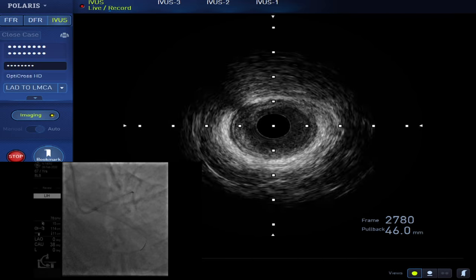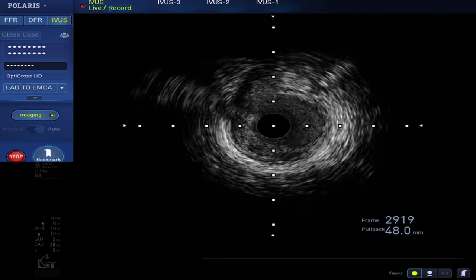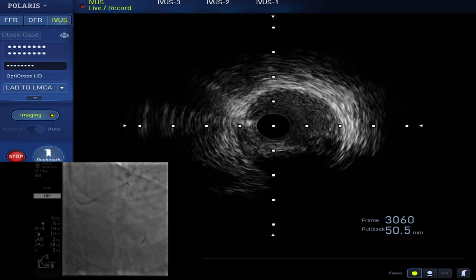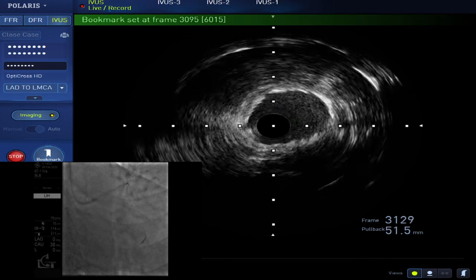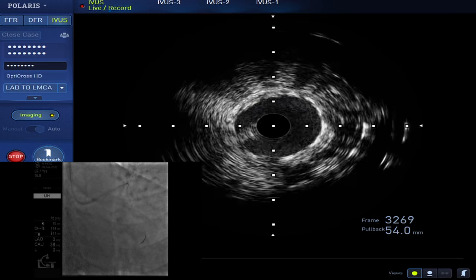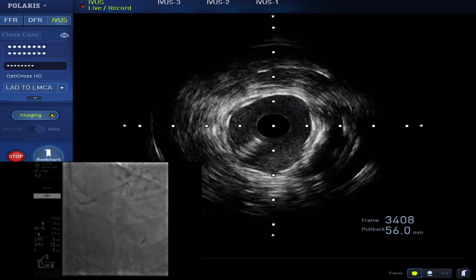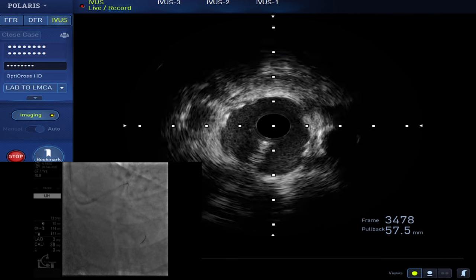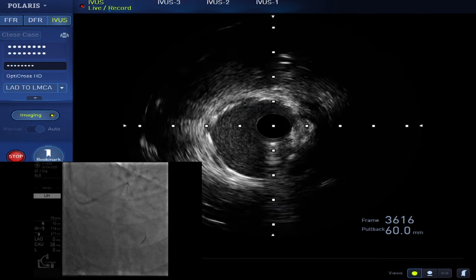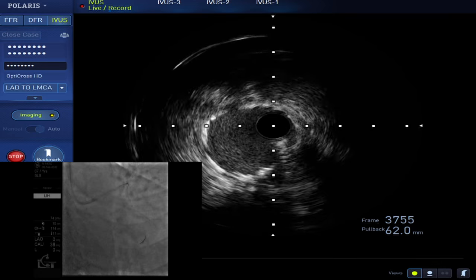Small amount of fibrous plaque, but it might be okay, right? Some branch, septal branch, comes. And we can identify some plaque at six o'clock, right? There is a stent. Yeah, it's a stent, and the stent diameter is 2.25, right? Too small. Here might be the three, right? Yeah, around three. And the distal edge is okay.